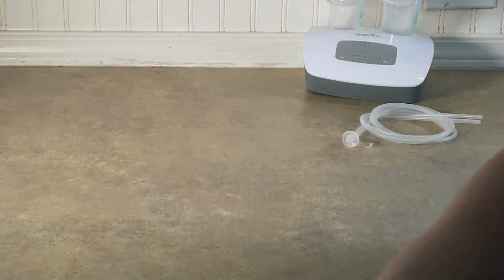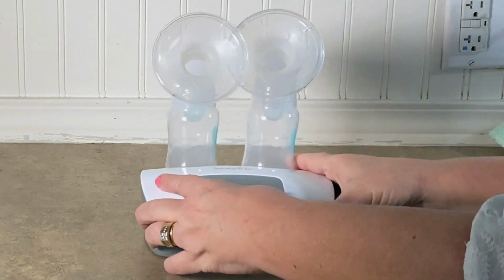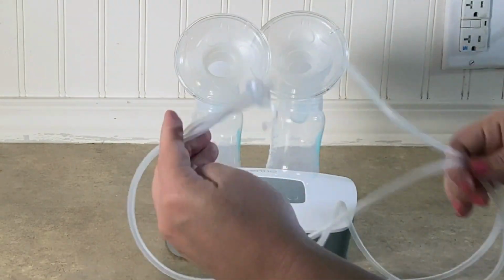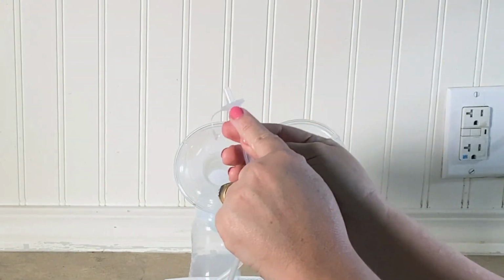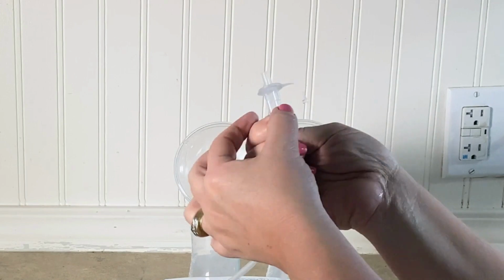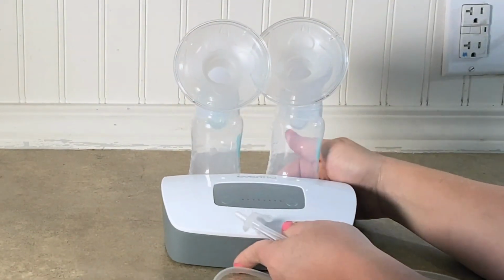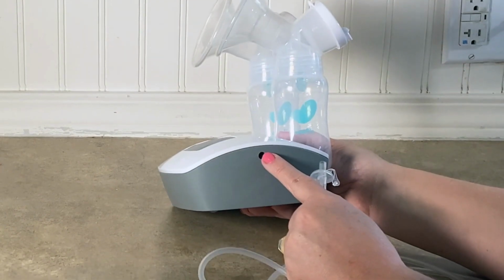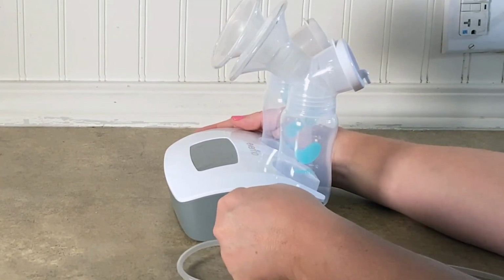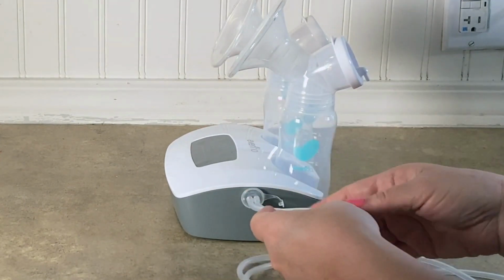All right, now let's go over how to attach the pumping tubing to your pump bottles. All right, here's the tubing adapter. You can see that both tubes are attached to the tubing adapter. That means that this is set up for double pumping. The tubing adapter plugs into the side of the pump right here. And when you press it together, press it really firmly, maybe give it a little twist. You just want to get it as flush as possible.